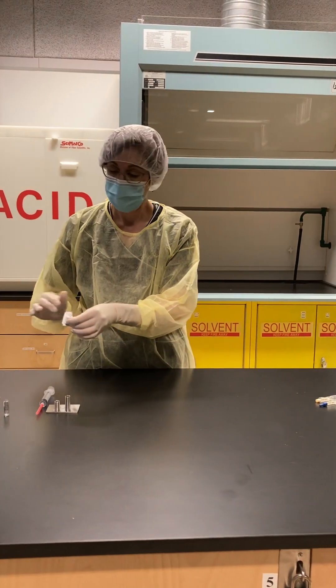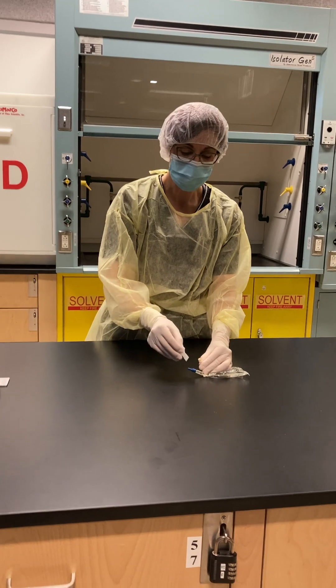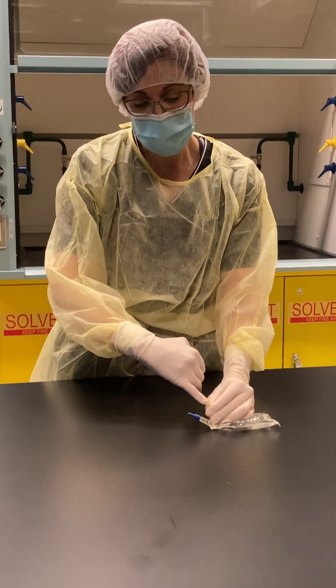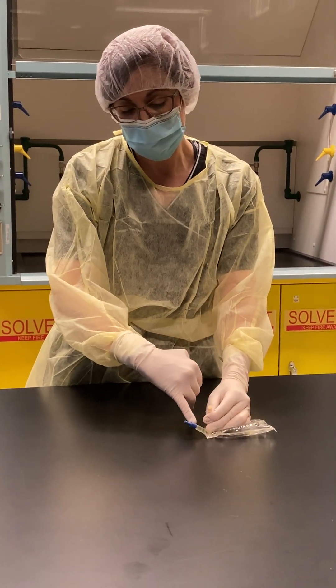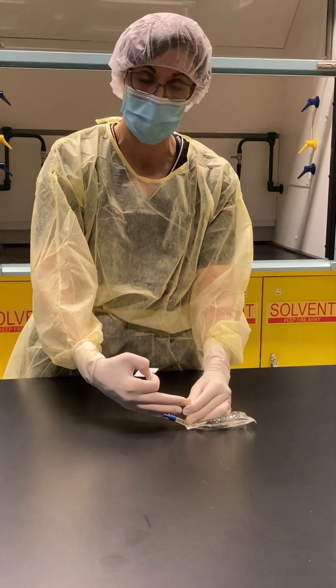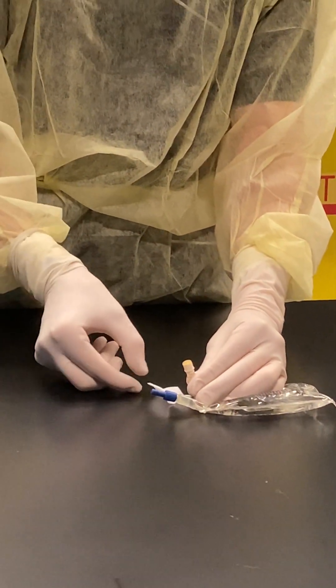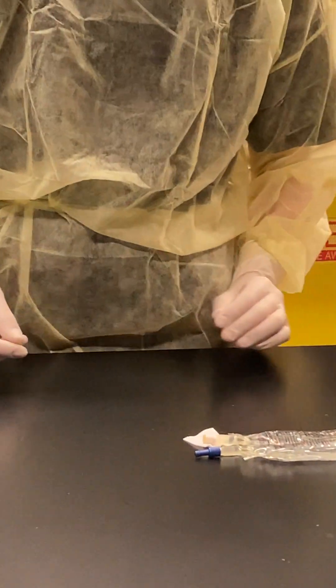I'm going to attach my new needle, then swab the port of my mini-bag. I always have my port slightly above the work surface and any other area so that the first air is always hitting my critical site. I'm going to let that dry.